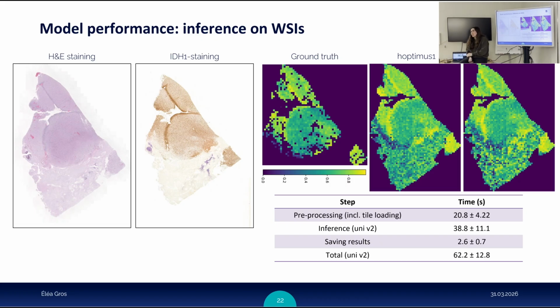And probably also if we train with more samples to start with, because now we train on 15 whole slide images, which is not a lot for these kinds of things. If we train with more, then the model will get more robust and will generalize better to start with. That's the next step. We haven't trained on any low grades, right? No. Which would be nice for the first submission, even as an appendix. We have to comment somehow about it. These are the most difficult cases to recognize on H&E, so this is where the more interest lies.